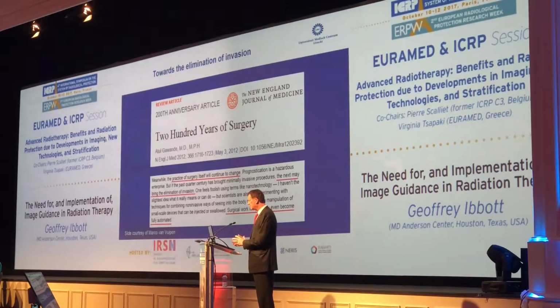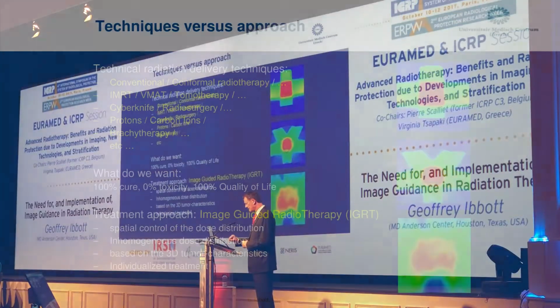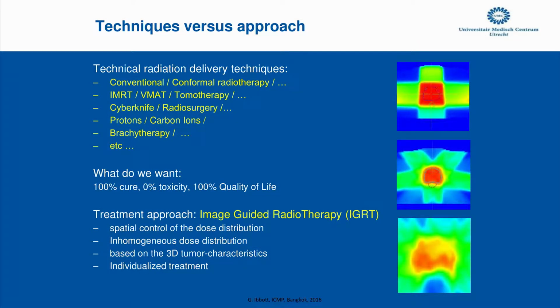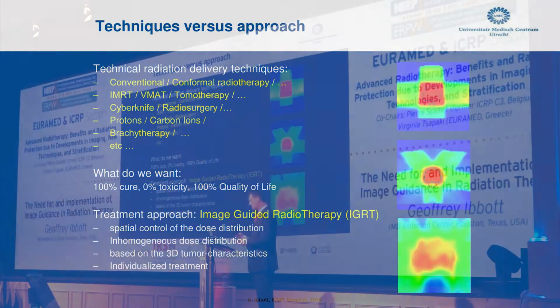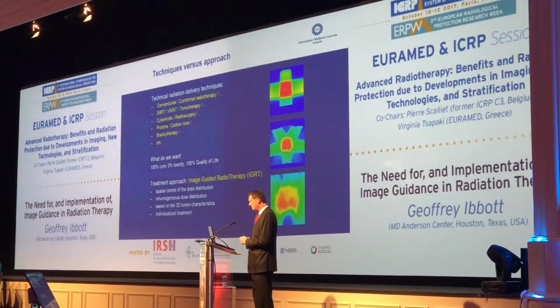And radiation therapy has made big steps forward as techniques have improved and has replaced surgery in some diseases or some stages of disease. And as we continue to develop techniques, we'll continue to do that. Our techniques do improve. As Dr. Gregoire pointed out, we have moved from what we called conventional conformal radiotherapy, or even simpler 2D treatment planning and delivery, where we treated large volumes of tissue in order to make sure we encompassed the gross target volume and the clinical target volume. And we've moved from that to modern techniques such as IMRT and VMAT, tomotherapy, radiosurgery, and ion beam therapy, as you see listed here, with the goal of improving cure rates and reducing toxicity.